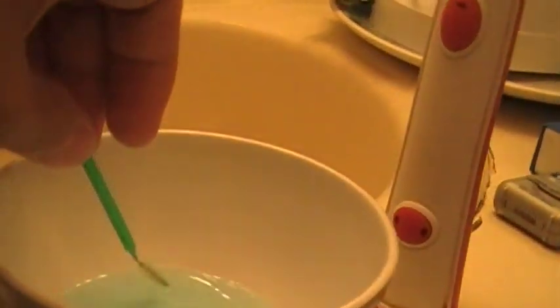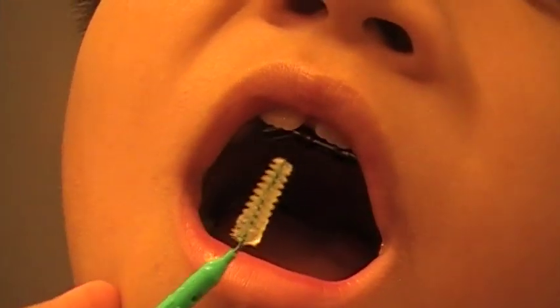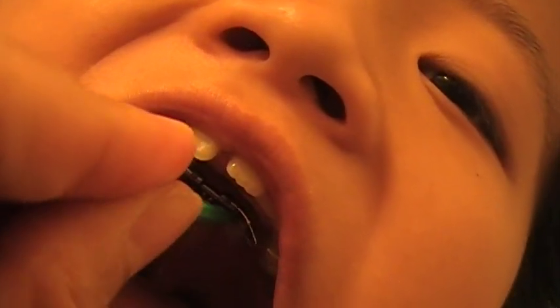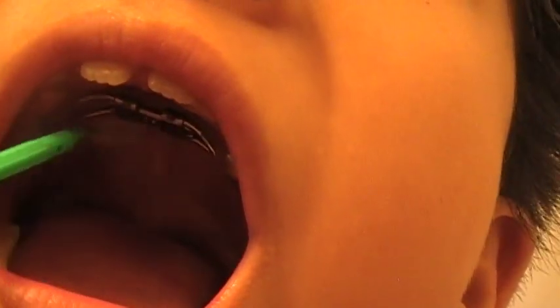Dip the brush in the solution, then have your kid lay back and open their mouth. Start cleaning the palate from the top part — brush it really carefully with the solution, making sure food particles come off from the top. Also clean at the bottom, be careful with the little corners on the side so that the food particles come off. Brush it really good, then repeat the process again.